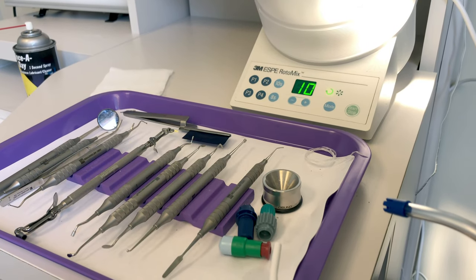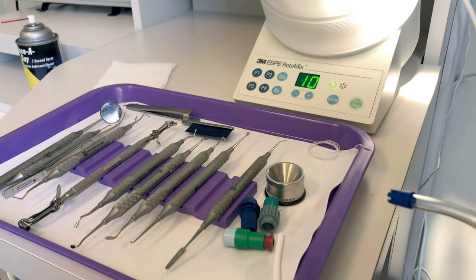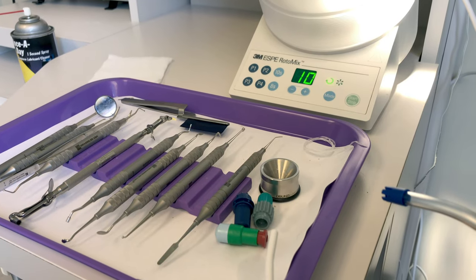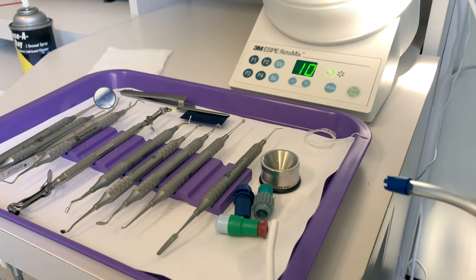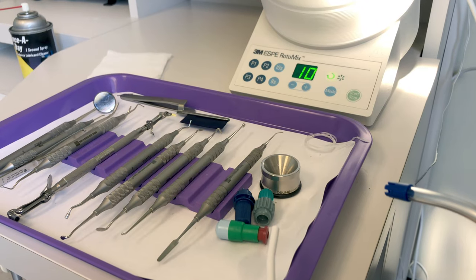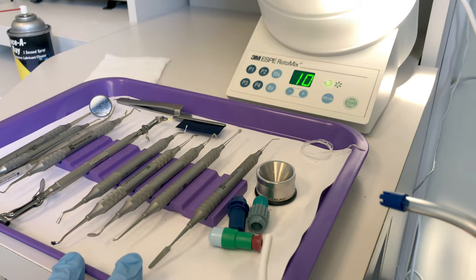Hi everyone, this video will show you an amalgam procedure from the perspective of the dental assistant. We have our amalgam tray already set up and the tooth has been prepared. We will be working on tooth number 19, a class 2 restoration MO preparation. Our instruments are set up in order and we already have a matrix band on the tooth.